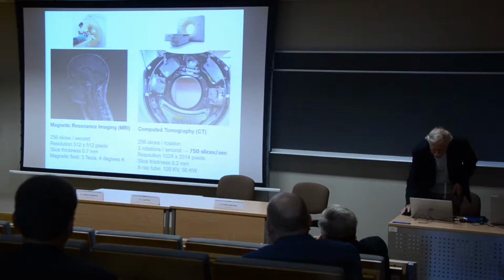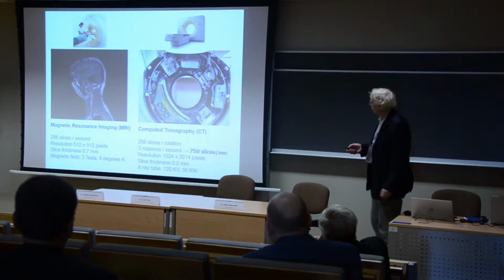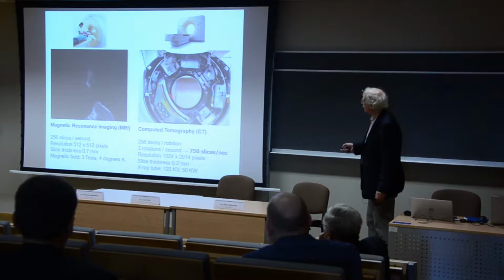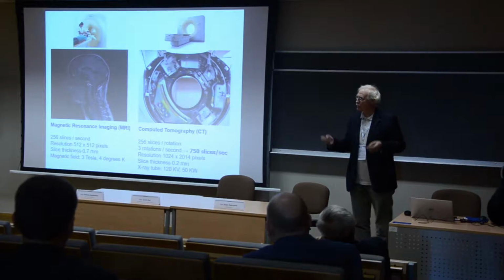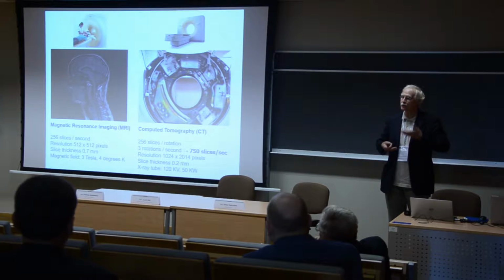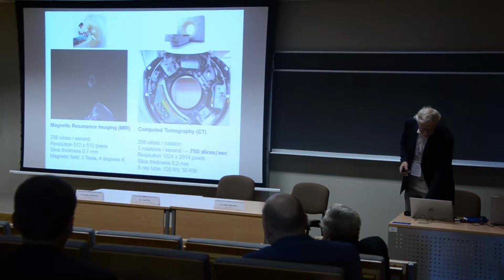You see the detector here, and this is now 1,000 detectors. So we make images 1,000 square with this incredible volume. And which doctor is going to look at 6,000 slices of the lung? We need computers to find these things.